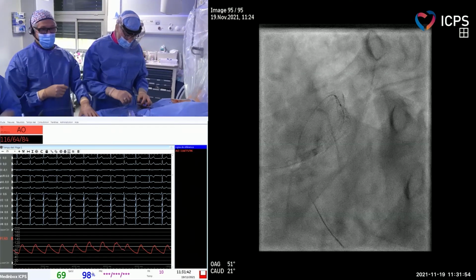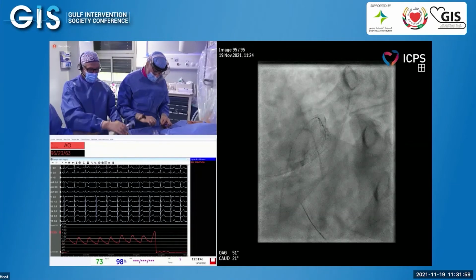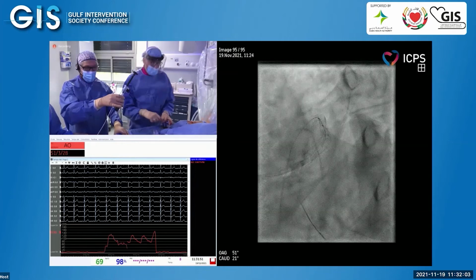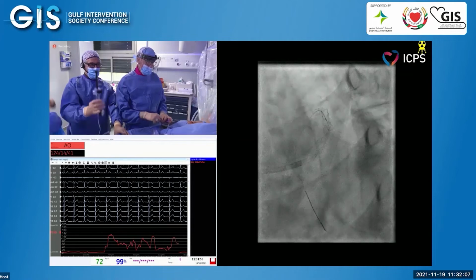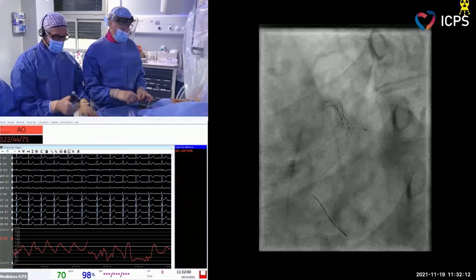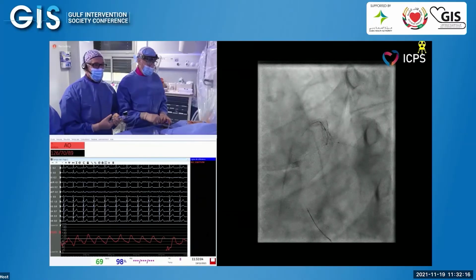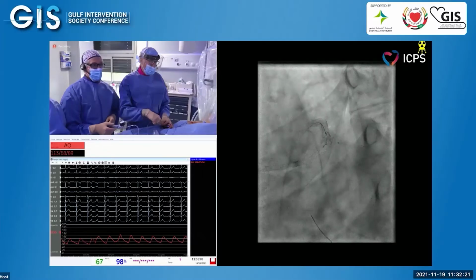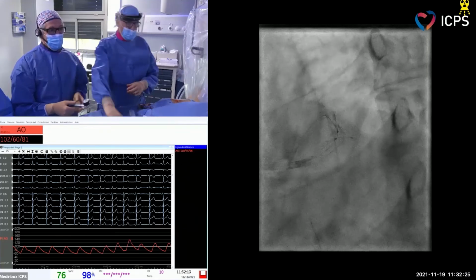Question, Dr. Moteri? Yes, Dr. Hani. Yes, thank you. Dr. Lefebvre, I just want to ask a question. I'm Henry Raghi from Cairo. Do you believe that the trauma of a balloon, which is a PTCA, on the proximal circumflex is worse as far as restenosis is concerned, or the imagined eddy currents? It's a good question, but in fact, it's not really a trauma. We just open the struts.